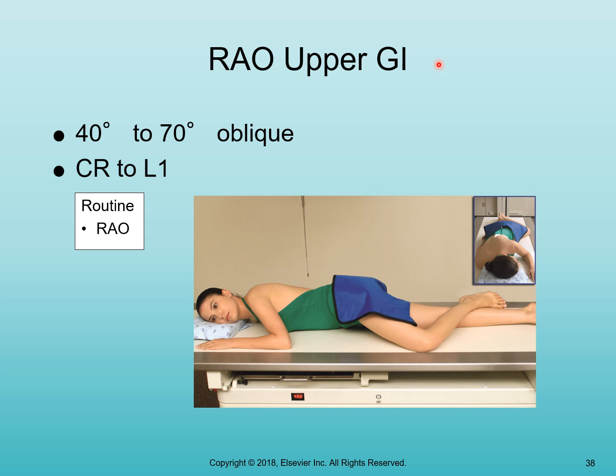You're basically taking the left side of the patient and you're finding the bottom of the lower border of the ribs, going 1 to 2 inches above that, and then halfway between the left side of the patient. That's ultimately what it breaks down to in what you're doing.